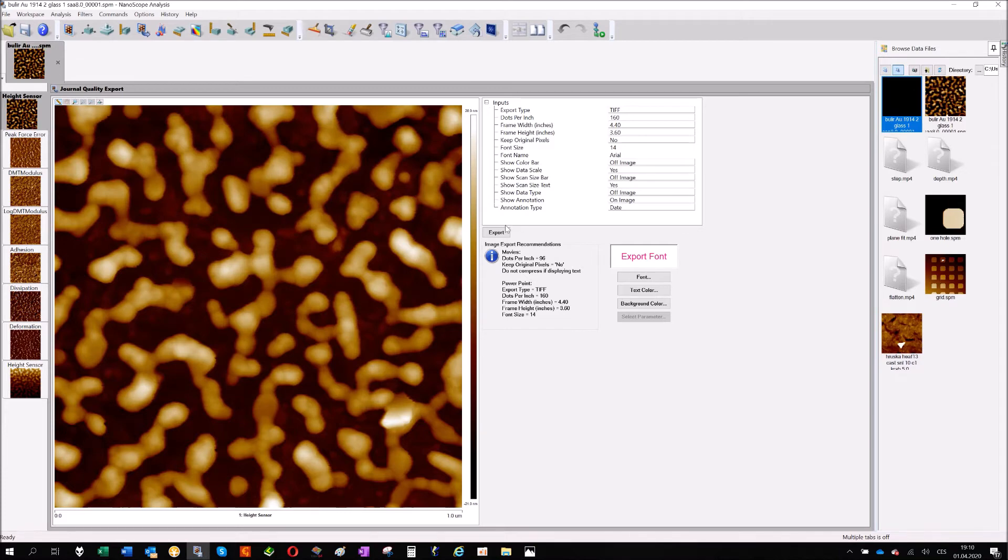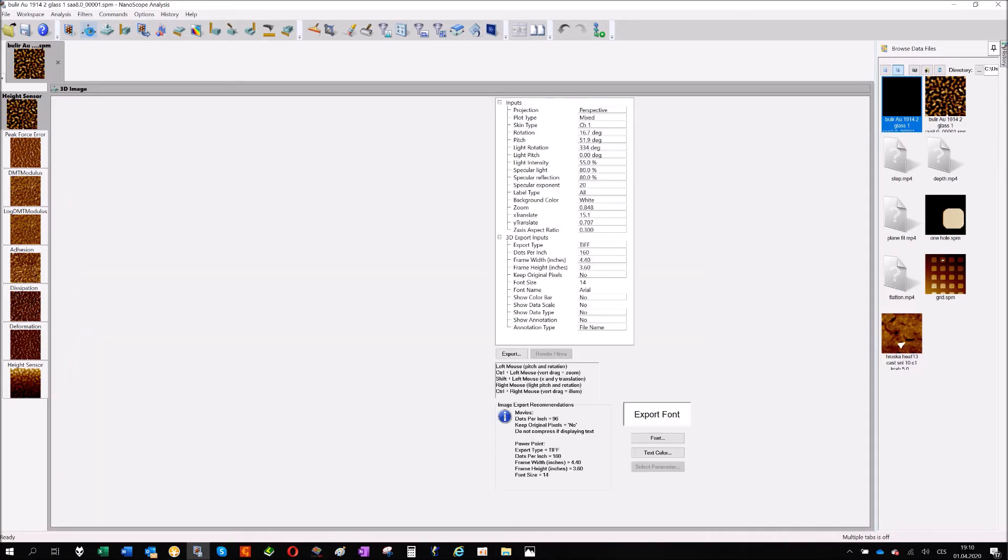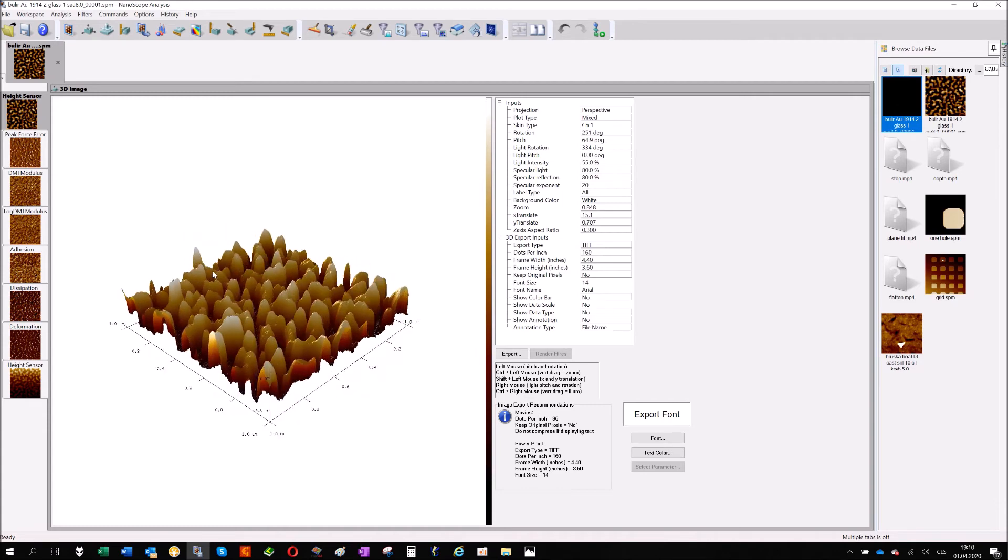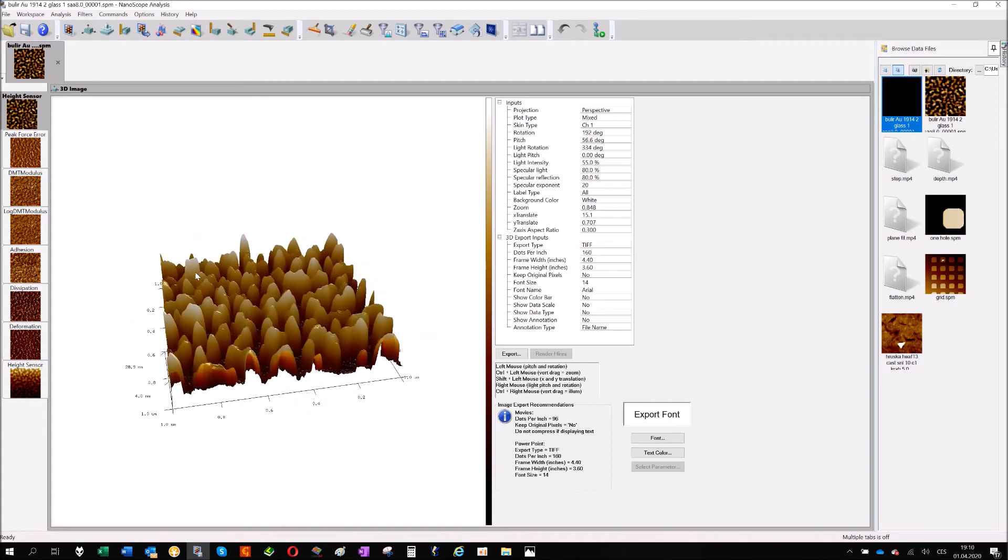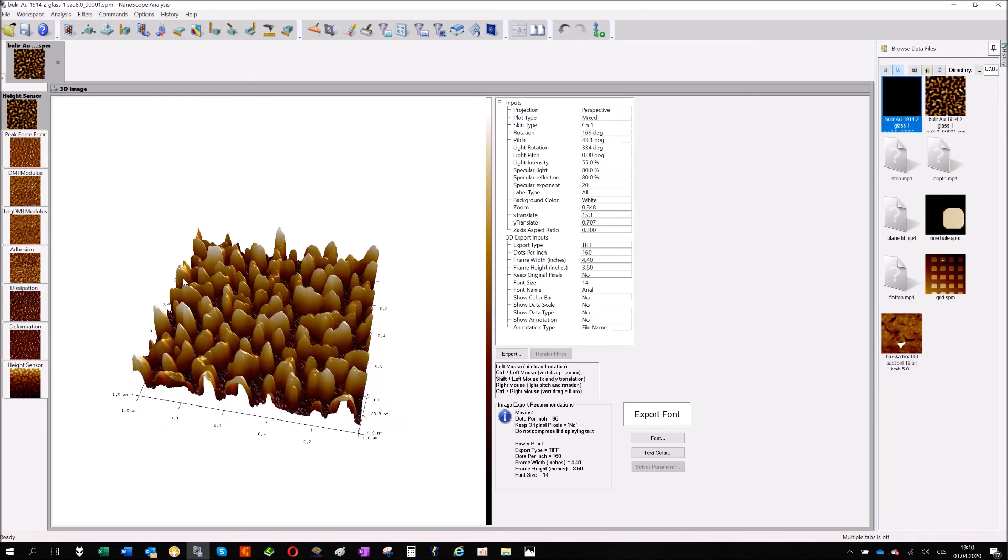We can also do that in 3D. And for that there is another button, another icon called 3D image. So I open it and you can see I already got some 3D image. That's the structure.